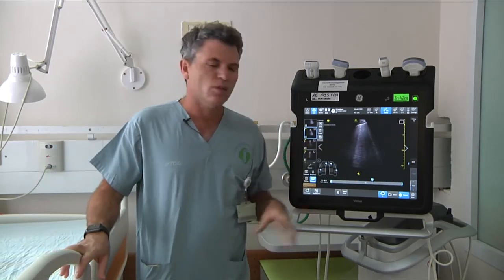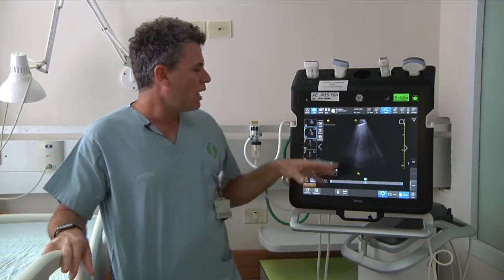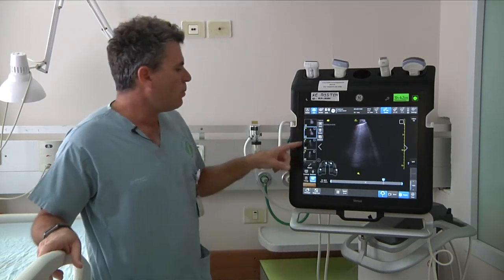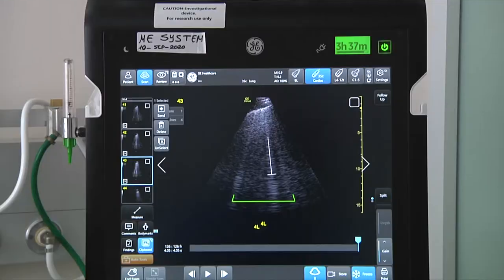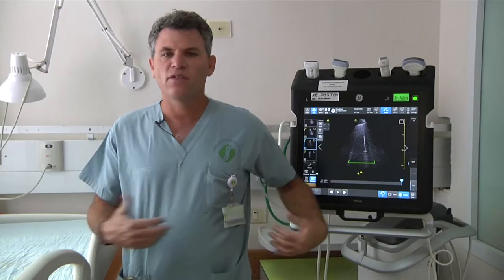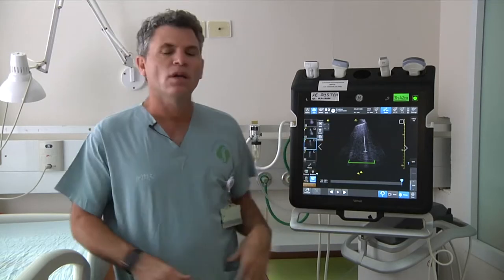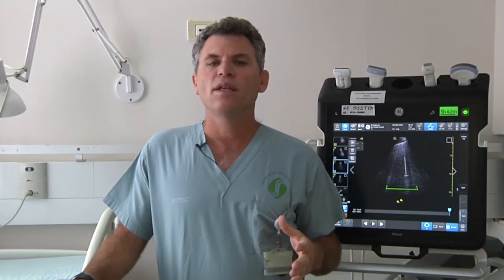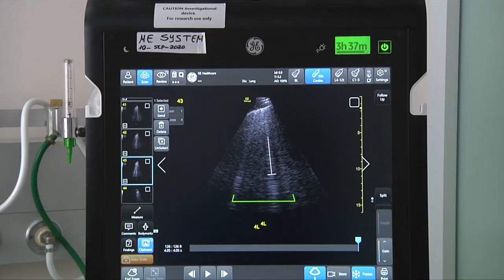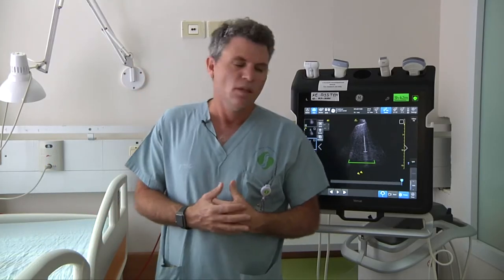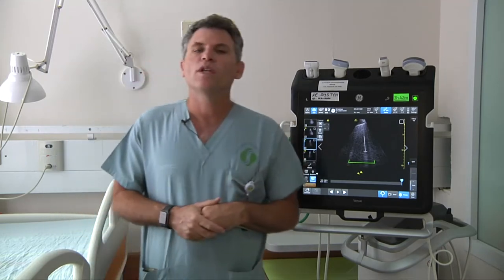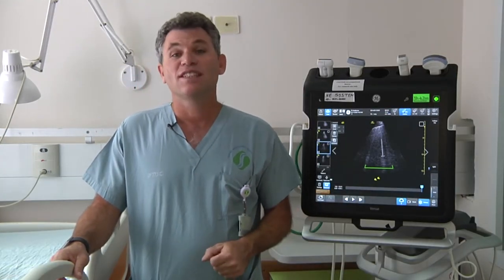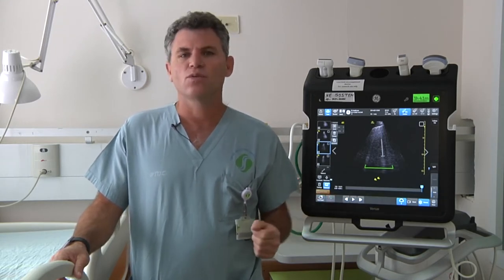As you can see here from the patient with a lot of B-lines, I know exactly that we were scanning at the left lower area. By using the automatic tool in real time, as I scan the lungs, I get a very accurate number that counts for me how many B-lines we have in the lung field. This is very helpful at the bedside because it saves time, and when you learn to use the automatic tool, you understand that it is precise and counts well.